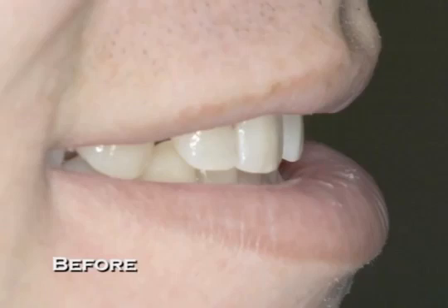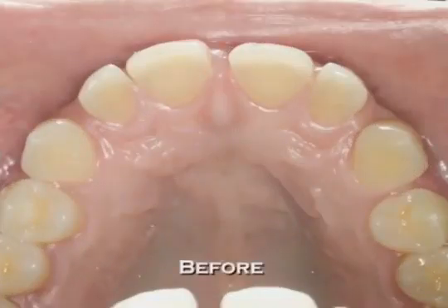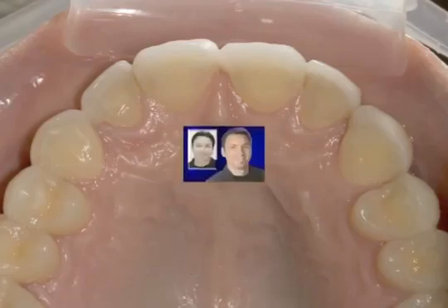We know that when we do a technique like this with the thin press veneers, they can be pressed as thin as 0.3 millimeters. But if a tooth is already too far out to the facial, adding another 0.3 millimeters to it is not going to solve any problems. In Chris's case, none of his teeth were inclined out to the facial, and that was another good indication for using no-prep veneers.